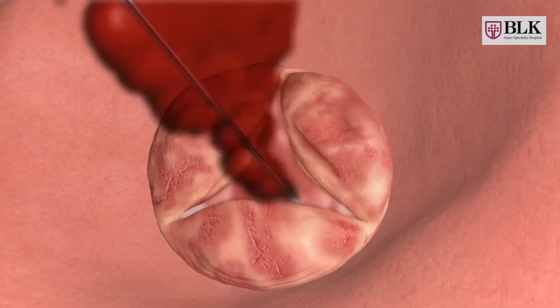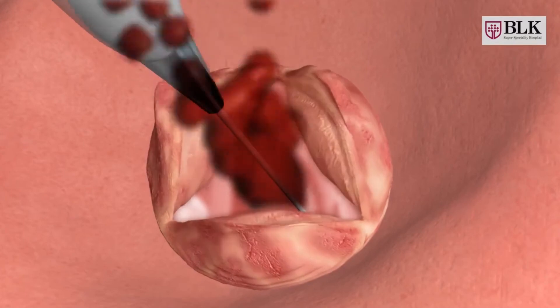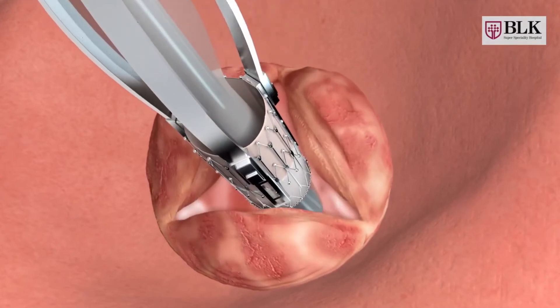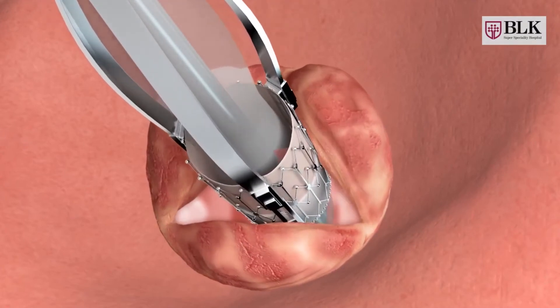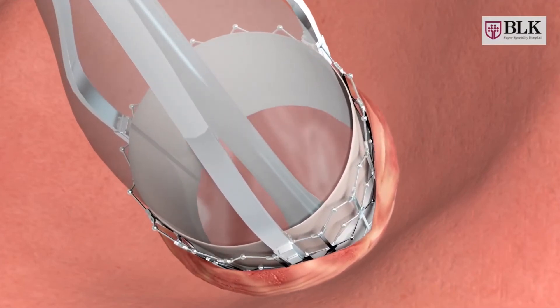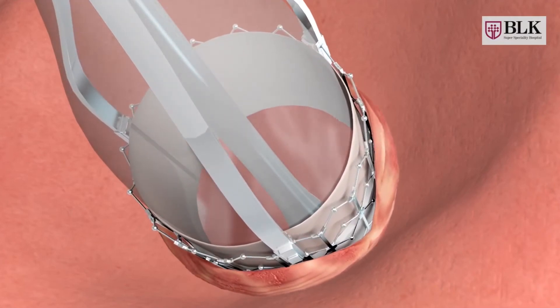Now we need to replace this valve, and the procedure that we are going to use is transcatheter aortic valve replacement. You can see that the new aortic valve — the transcatheter aortic valve — is being inserted in place.